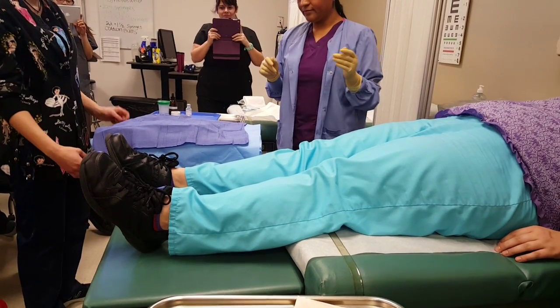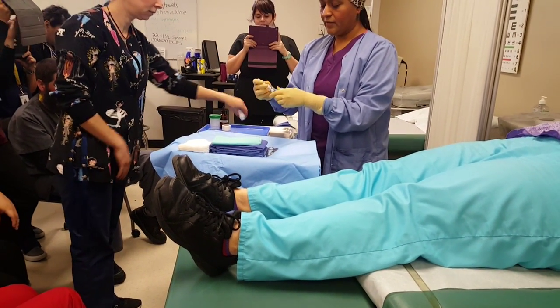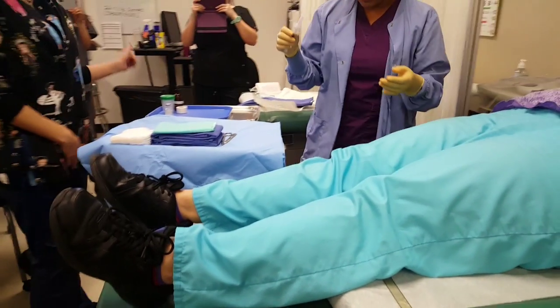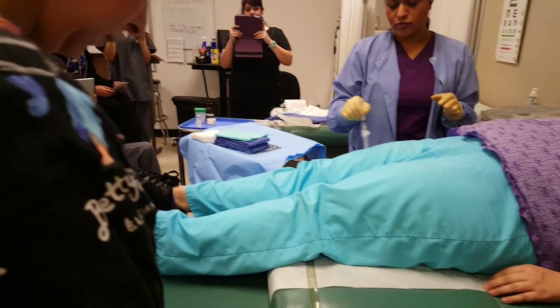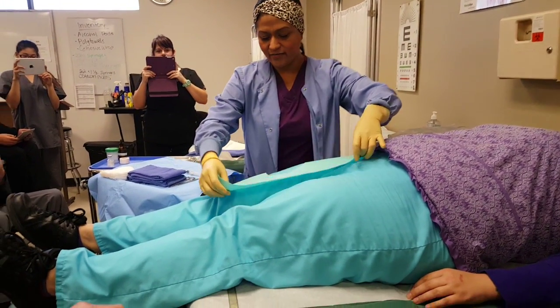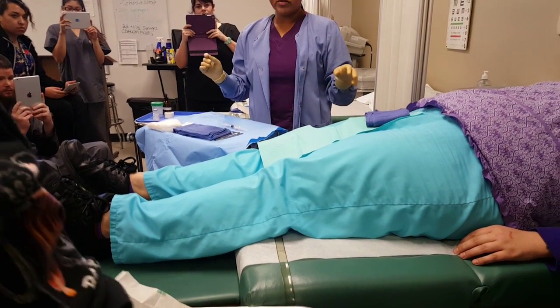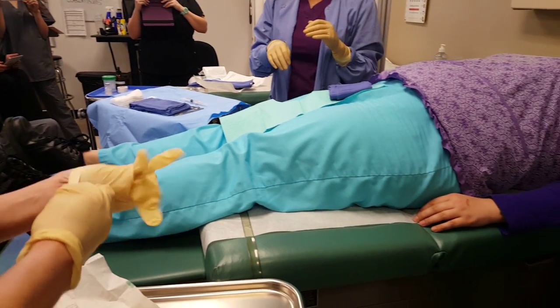Miss Newman lifts the towel — she can't touch the sterile items yet. The doctor requests anesthetic; Miss Newman draws it up and hands it over. At this point Miss Newman can start gloving up because the doctor is beginning to anesthetize the patient. The doctor anesthetizes the site and applies the fenestrated drape. The extra towels are not just for the base — they're also there in case of uncontrollable bleeding.